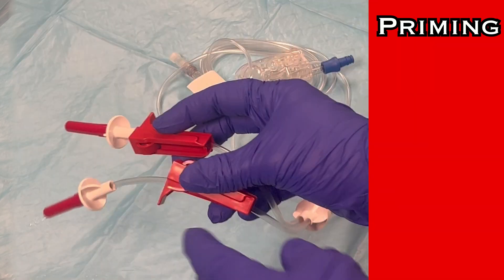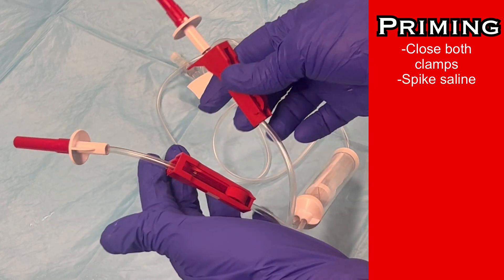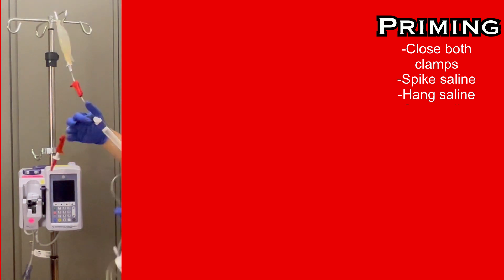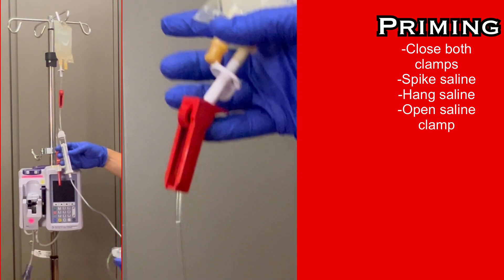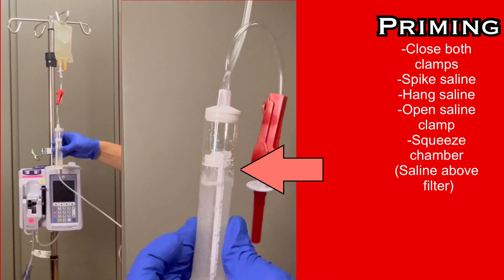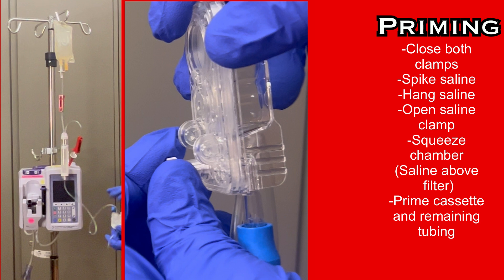We will begin by priming the tubing with saline. Close both roller clamps. Then connect the bag of saline to one of the spikes. Hang the saline bag from an IV pole and open the roller clamp below the saline. Squeeze the filter chamber multiple times to draw in saline until it fills to just above the top of the filter. Then continue to prime the cassette and the rest of the IV tubing with saline, as you would a normal primary IV tubing line.